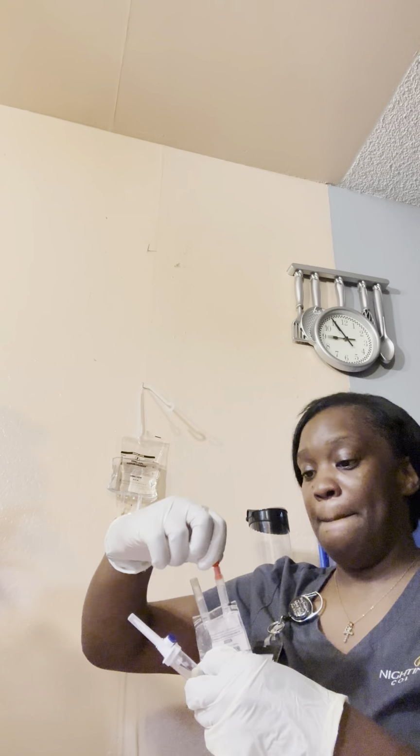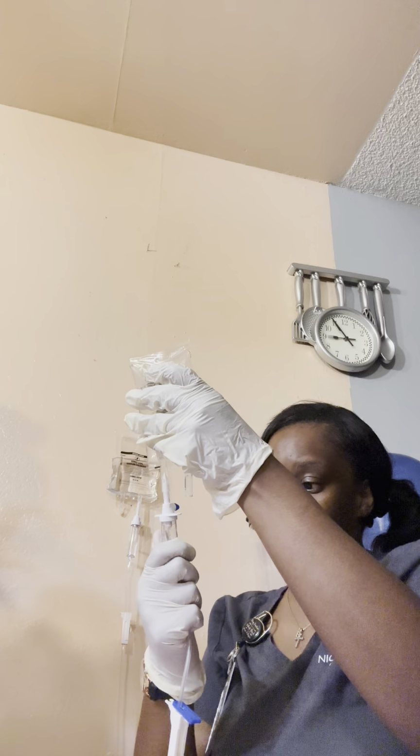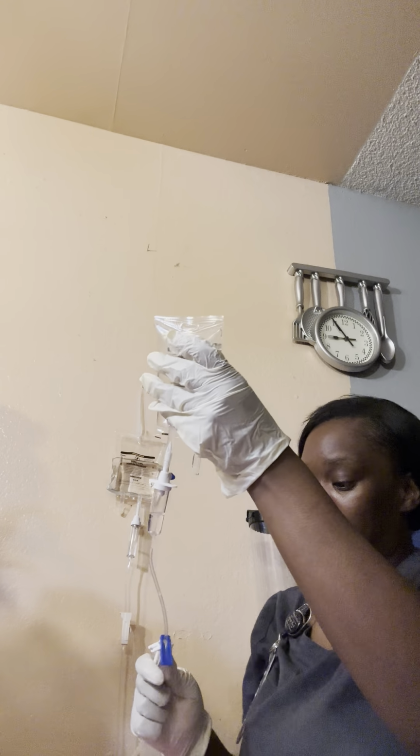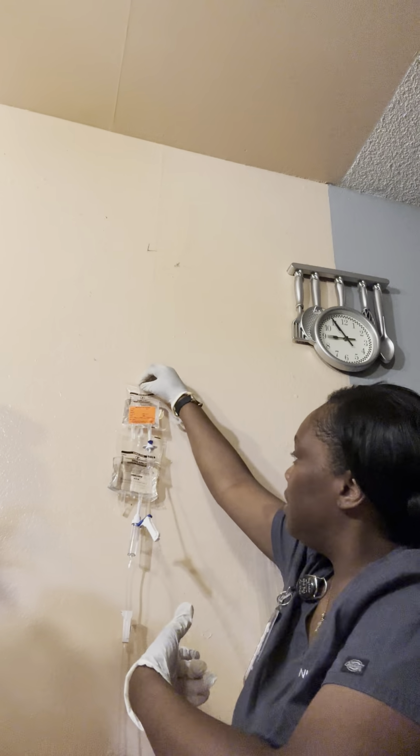You're going to prime your medication bag, remove the top to the spike. Place that in there. Again, fill your chamber enough to get the air bubbles out, about halfway through. My clamp is locked. We're going to hang this bag above our fluids.